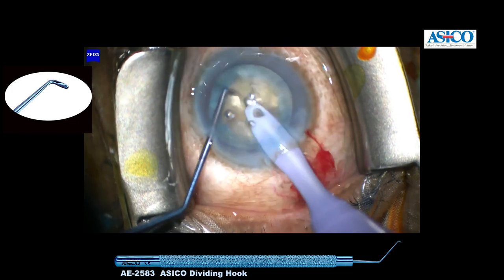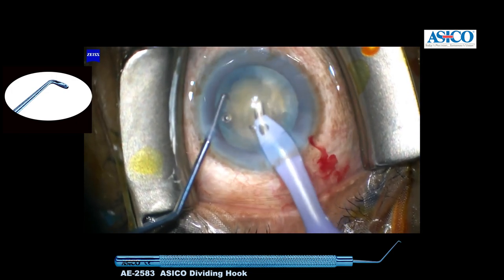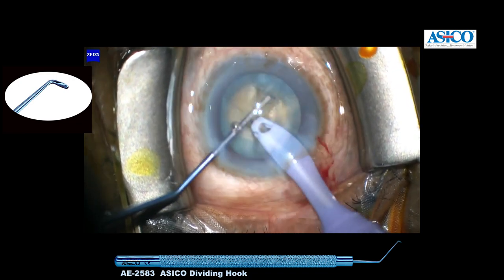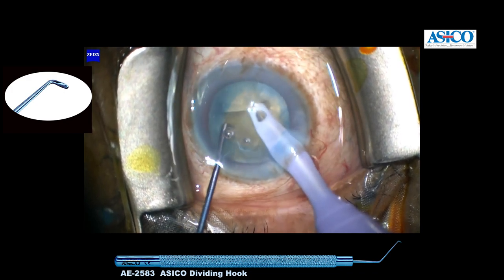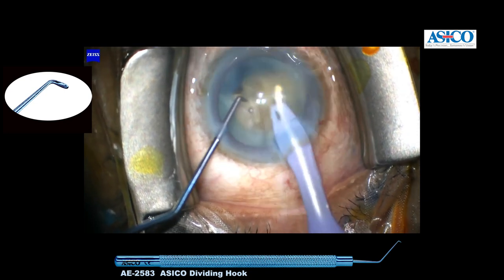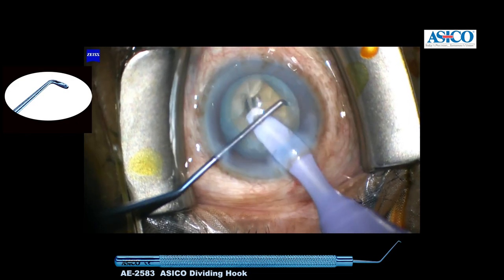The flat surface acts as a very good spatula-like surface to separate out, and the flat surface is always aimed towards the side port. This gives fantastic leverage and a very easy and clean chop with minimal effort.